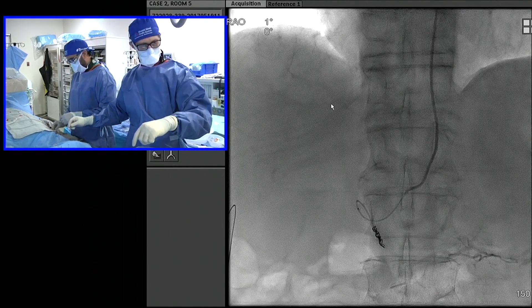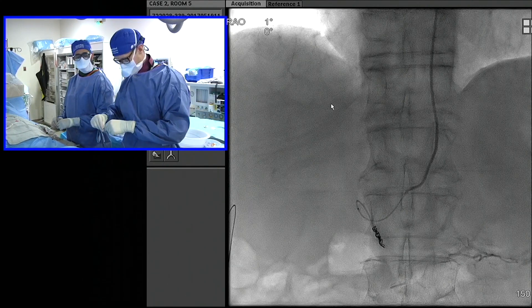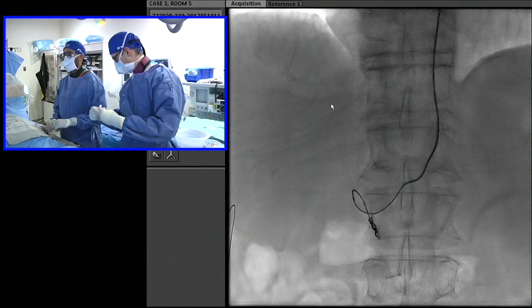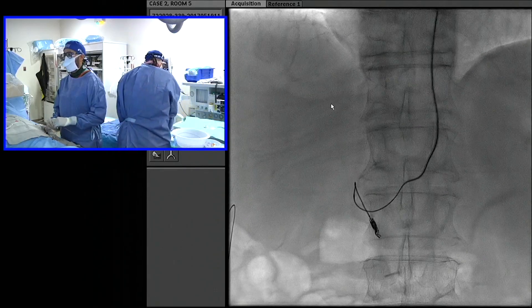It's a tenuous spot — the left hepatic artery is huge, so it's making it a little bit tricky. We're going to put this packing coil in here quickly and see if it packs. You can see the POD packing coil is actually packing quite nicely.